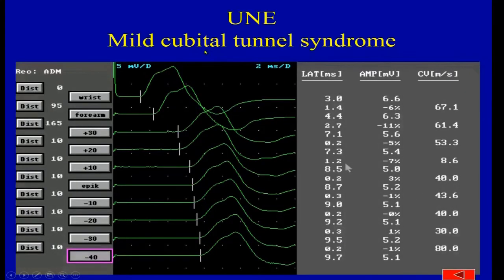At the humero-ulnar aponeurosis, we have a tunnel which is distal to the sulcus ulnaris, and here is the result: the sulcus is here, and here is below 2 steps, and then all of a sudden we have this jump distal to the sulcus ulnaris, and then nothing above.